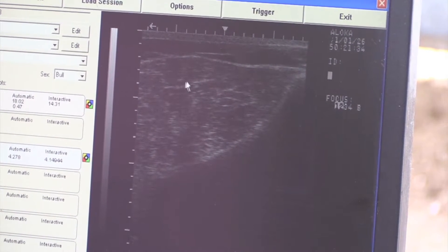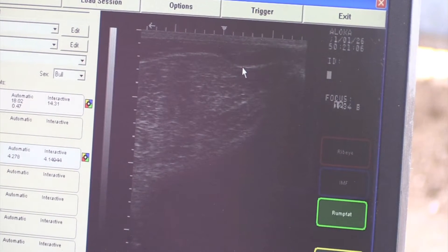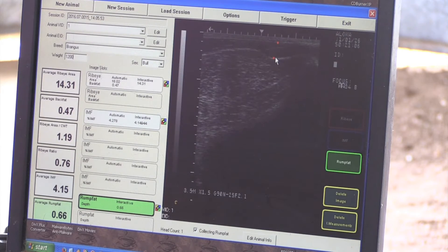You just get a good clean image. We're basically looking for this one spot, and what we're going to do is measure. Place our cursor right there, and then we come up here to the top, where the top of the back of the rump fat is — right there. And we get 0.66 inches of rump fat on her.